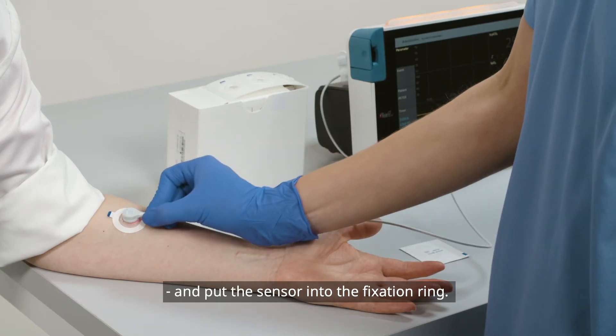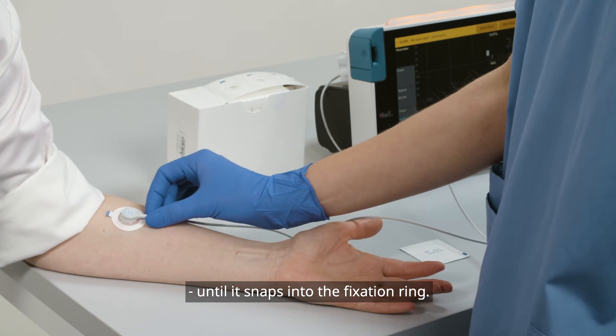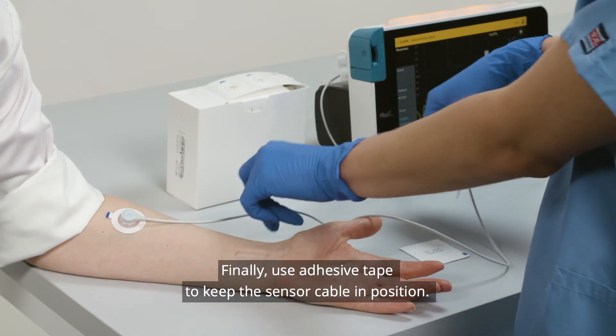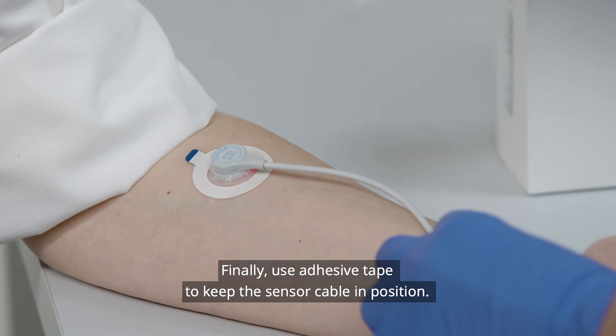Hold the sensor neck and put the sensor into the fixation ring. Press the sensor gently until it snaps into the fixation ring. Hold the sensor neck and twist the sensor into the best position. Finally, use adhesive tape to keep the sensor cable in position.